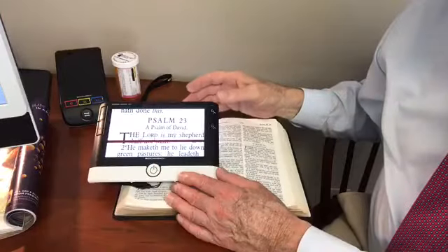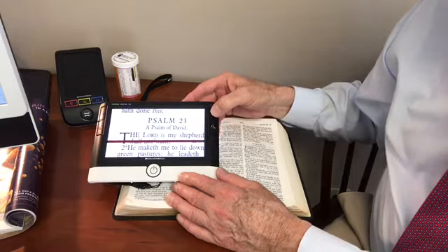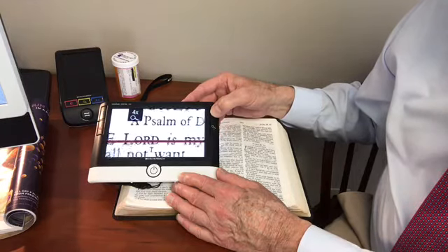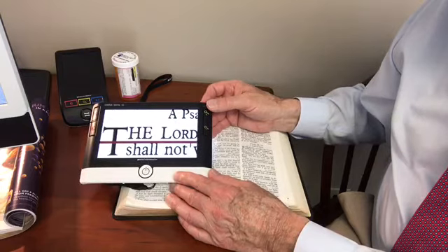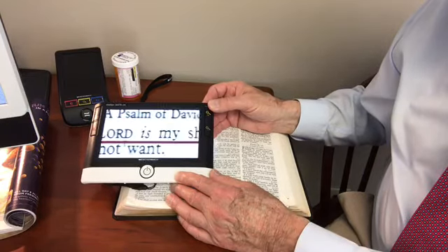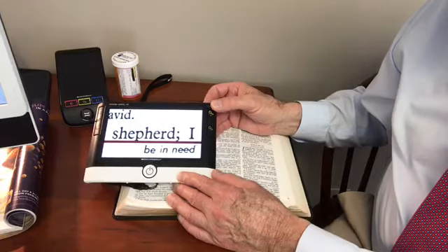Very nice device, very portable. This handheld video magnifier has a number of very interesting and useful features. The magnification can be increased, and when you've reached a magnification that's sufficient, you can position the device at the beginning of the line and gradually work your way toward the end of the line of print.